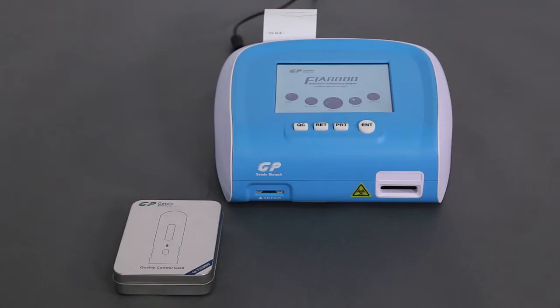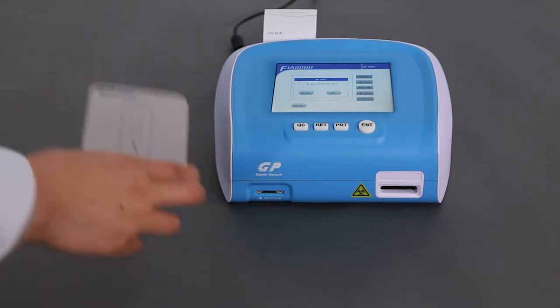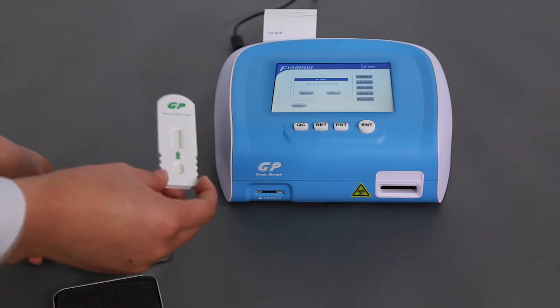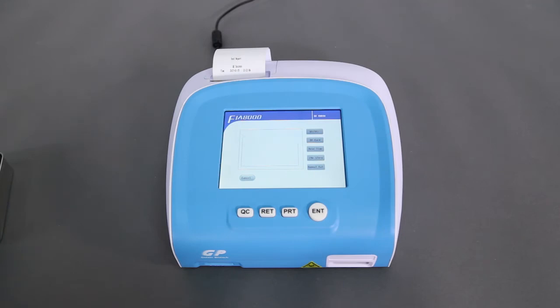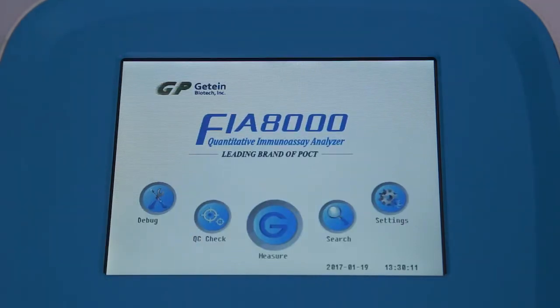It is recommended to perform quality control with the QC Card every other month to ensure correct operation. Click QC Check, then QC Card, and take the QC Card out of the aluminum box. Insert it into the test port with the round head inward. When you hear a click sound indicating the card is in place, click OK to complete the process. Each analyzer is equipped with only one matched QC Card — please keep it safe. Press RET to return to the main interface after finishing.